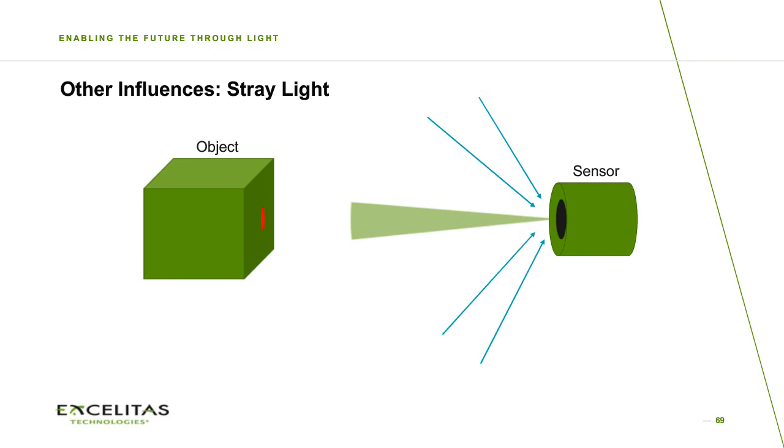Then you put such a sensor in this particular application of a face scanner. Let's say like this, you don't have a fixed distance between the sensor and the object, because the object is your head and you cannot stand completely still, which means you're changing the distance between the sensor and the object. Of course, there is one thing which is changing, which is the coverage of 1 pixel with respect to the hot surface which you're looking at. The closer you get, the smaller the coverage at the object is. So this changes already slightly the temperature reading.